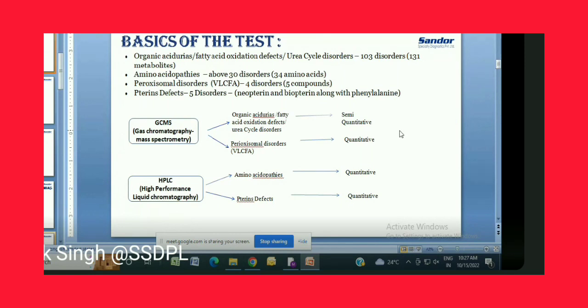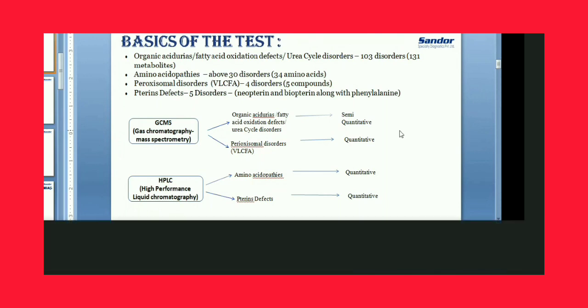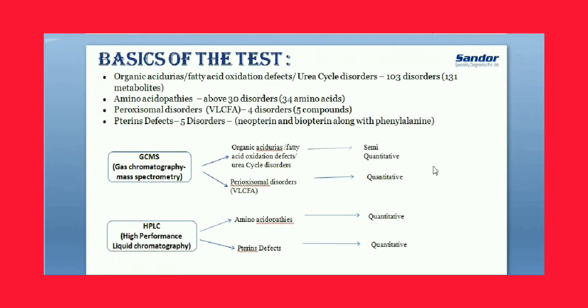You can straight away tell the doctor, this is our report format. It makes it very easy to know which analyte is abnormal. We report only those analytes which are significantly elevated and have clinical significance, and only those analytes would be interpreted.